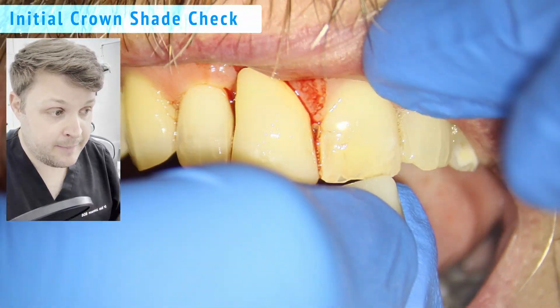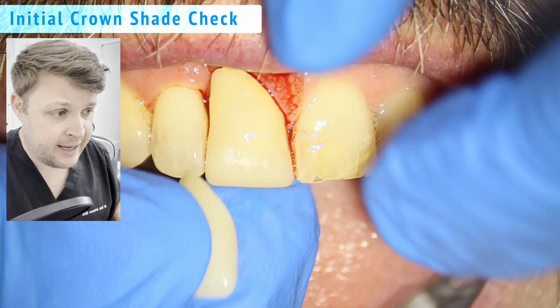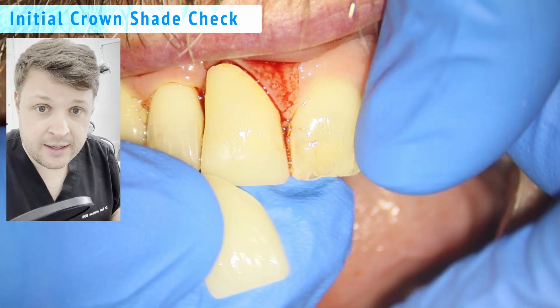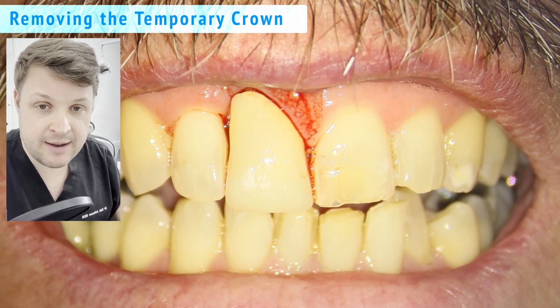At the moment the tooth has a temporary crown on it. During the numbing process I'm just getting the zirconia crown out and checking the shade to make sure everything's okay.